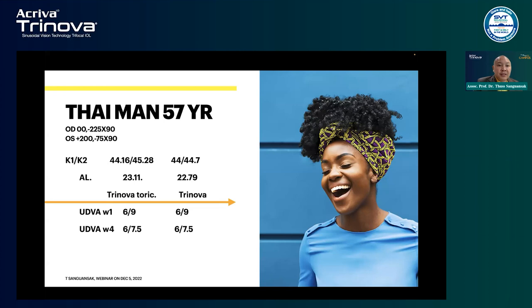I put a different design on each eye. On the right, we put the Trinova toric, and on the left side, the Trinova. The outcome was pretty good. In the first week, he got the vision to 20/30, or 6/9, and at one month he saw better and got a very good result.